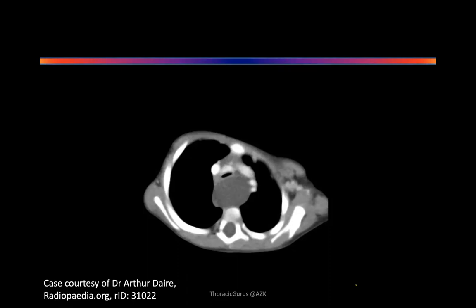Sorry, who said esophageal dilatation? Is it acceptable? No, this is not esophageal dilatation. There is a cystic lesion here. You cannot see the esophagus here; it is somewhere in there, compressed. This is not esophageal dilatation, because what you see in esophageal dilatation is air. There is always air in an esophagus, okay? Here, this is a cyst. This is not esophagus.